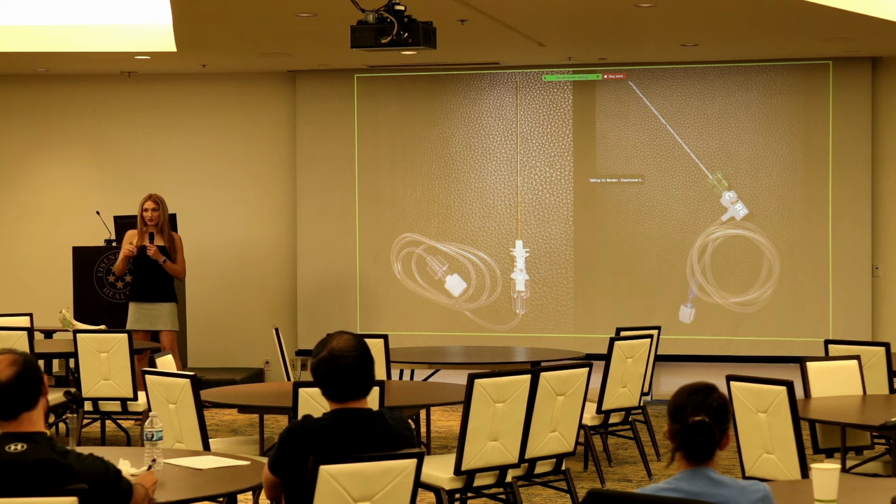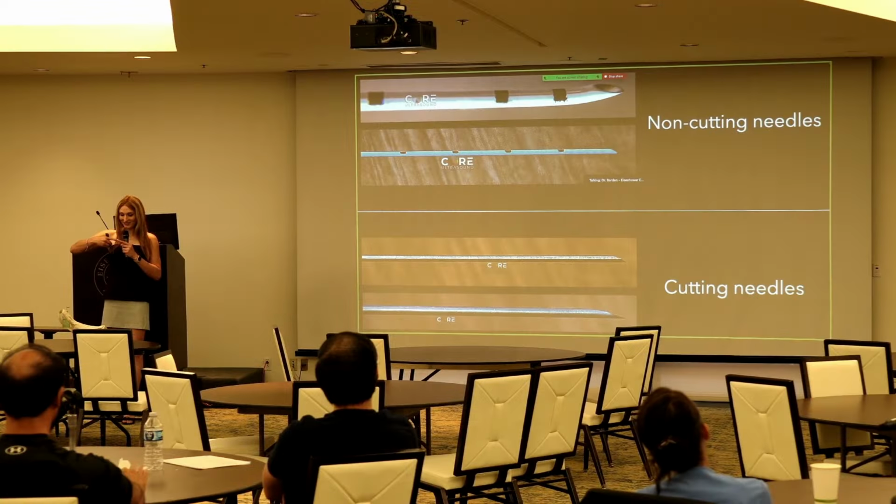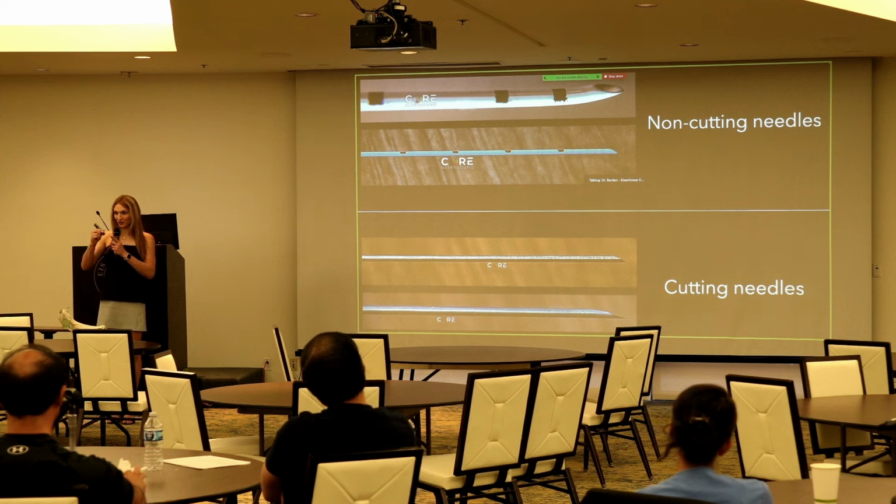just so I can have more control. And if you have those blunt tip needles, which you should be using, by the way, sometimes it's a little hard to get through the skin, and you're going to tent the skin and tent the skin and tent the skin, and then finally it'll pop, and then the skin retracts and you're 5 centimeters in the patient already, right? That's another reason why I hold it here, because my fingers are a stop. So once I get it in, it's not going to go past where my fingers are.